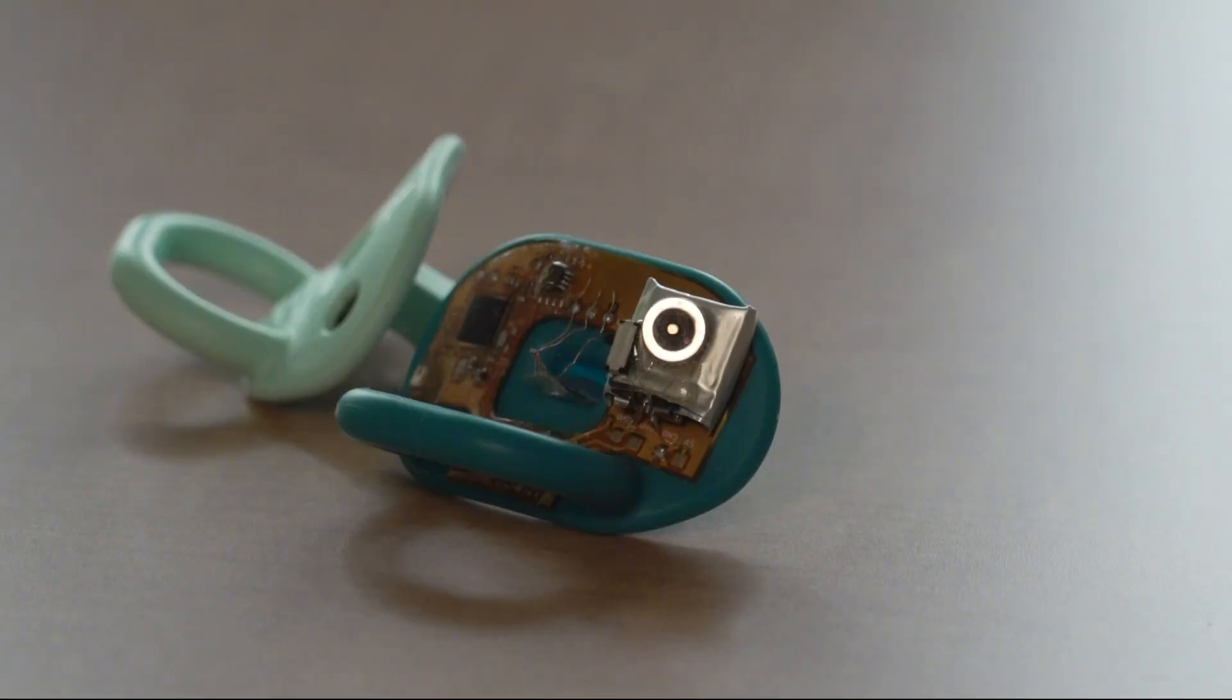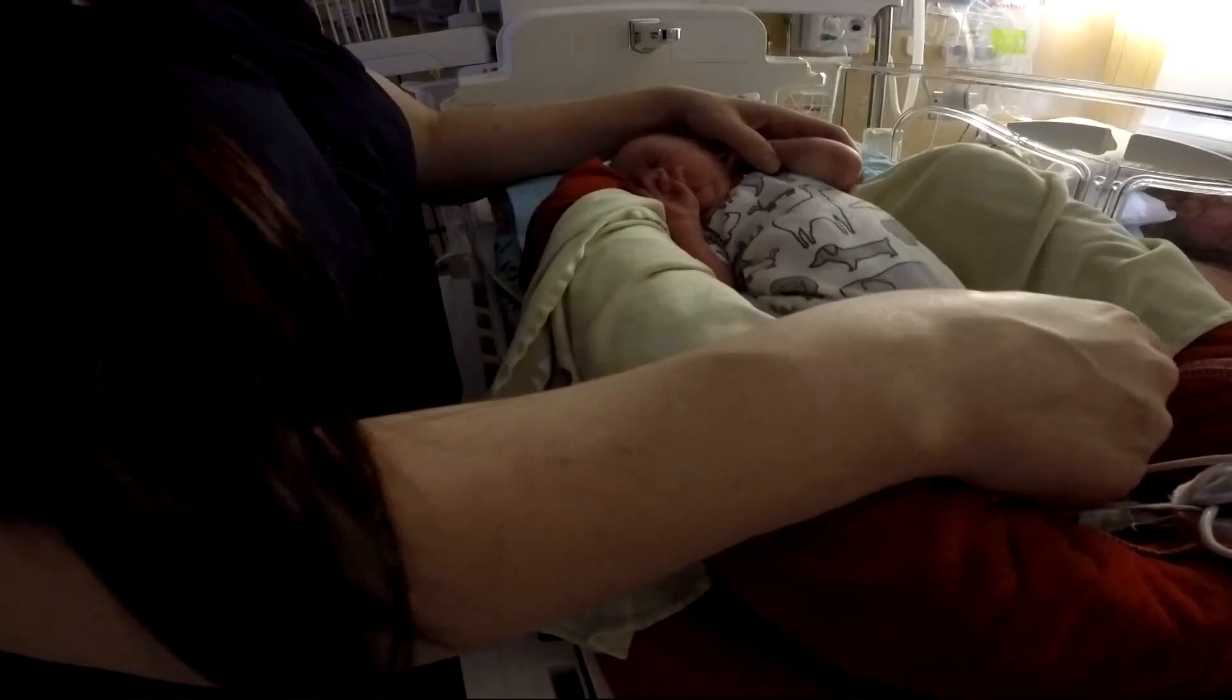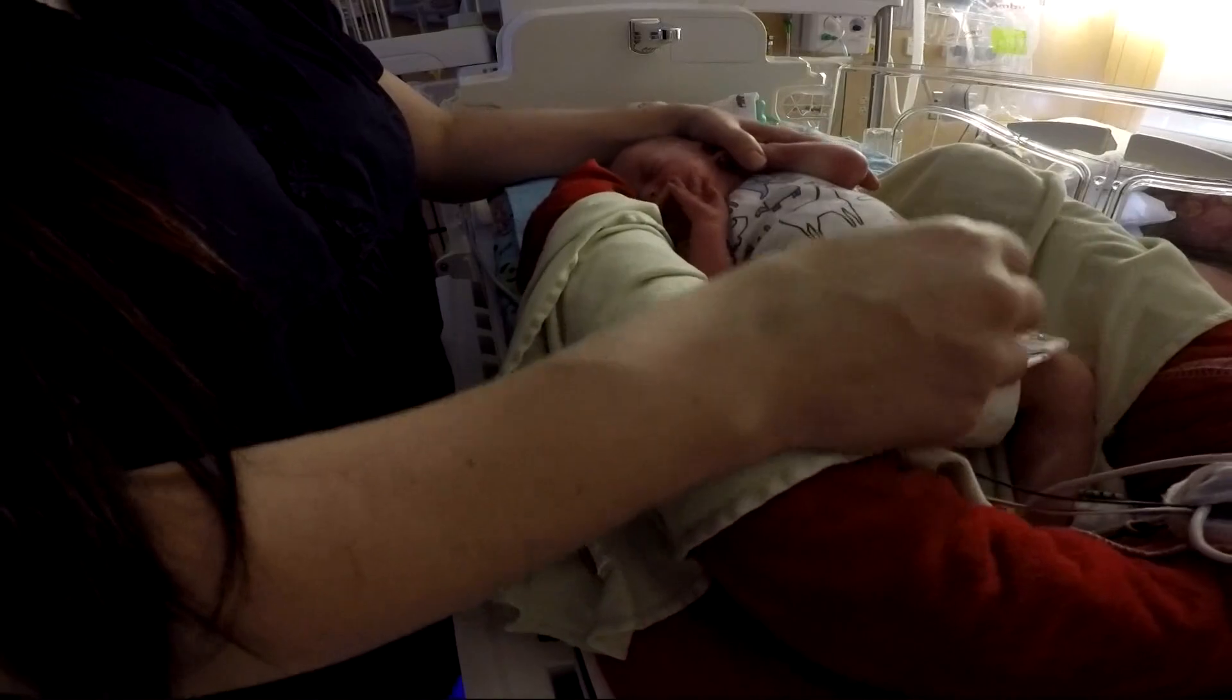The smart pacifier we've developed can automatically collect the saliva sample from baby and continuously monitor their ion level in real time.